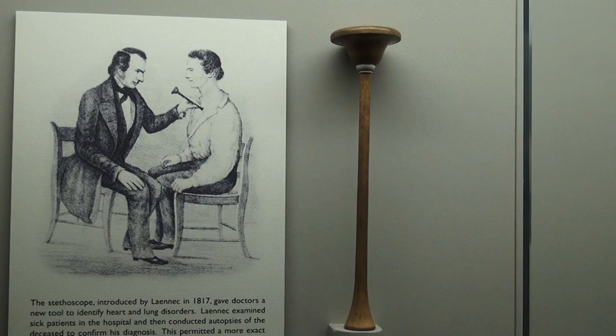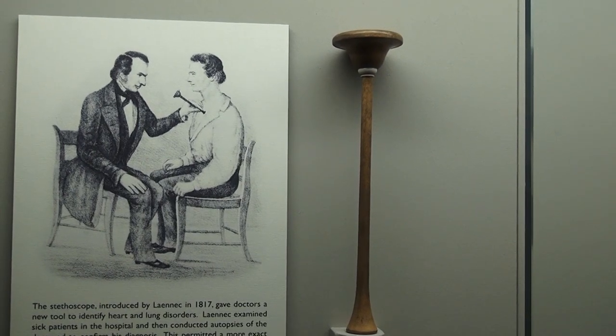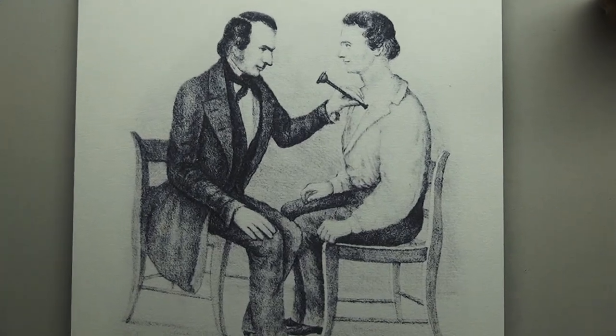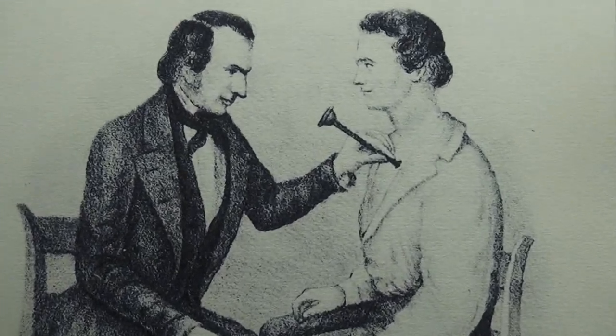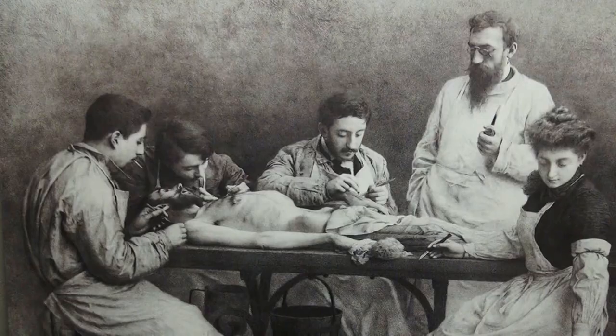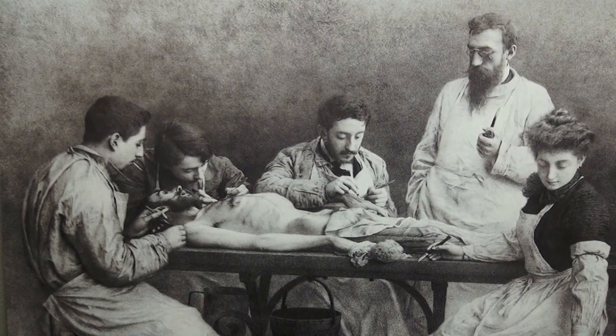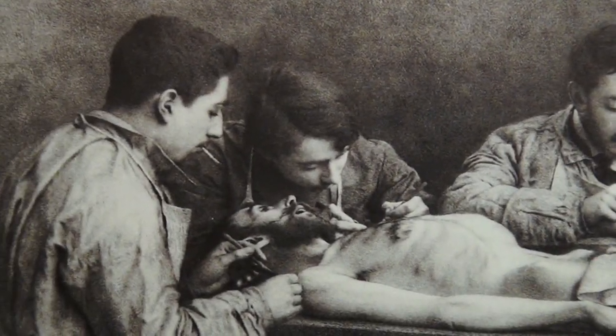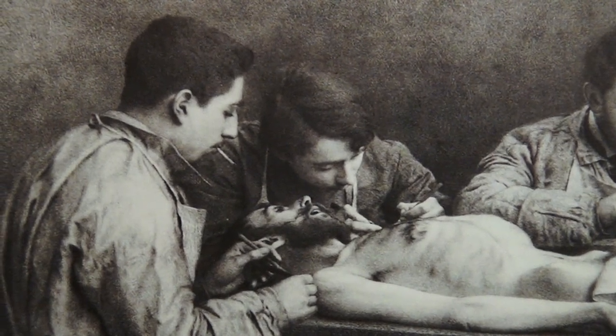The introduction of instruments for physical examination started with the stethoscope. Here we have an image from 1850 in Ohio where a doctor is using a monaural stethoscope. He listened to the heart and lungs to identify disease, and then doctors would confirm findings — if the patient died — through dissection and autopsy, looking for lesions and tumors produced by those sounds.